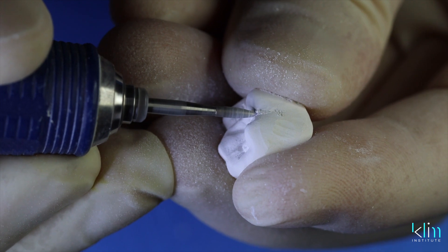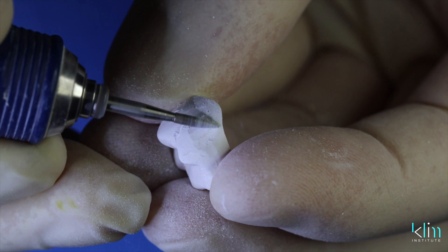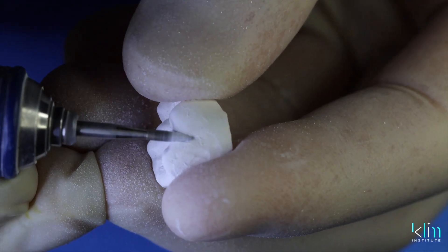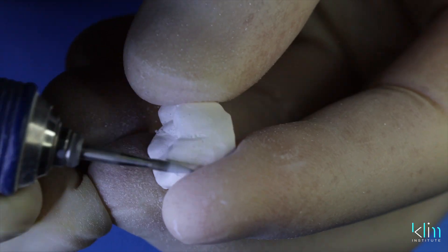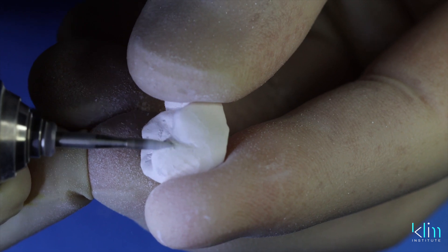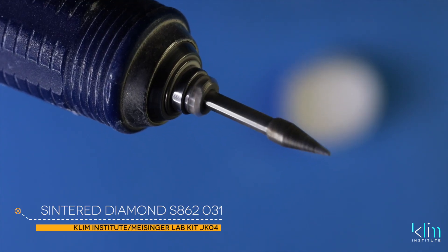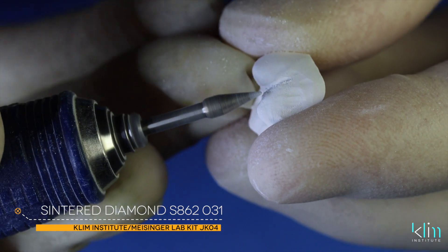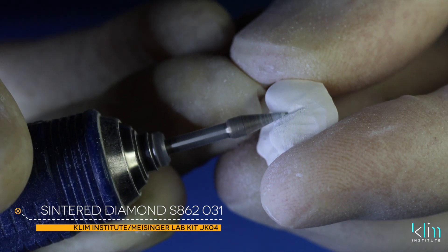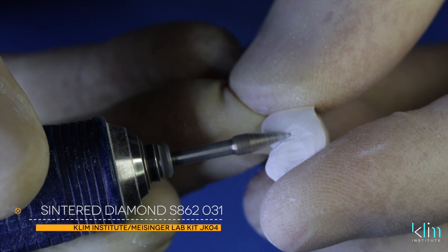On the buccal, we're going to spend a little more time refining that buccal groove so there's more separation between the mesial and distal cusp. Remember, the mesial cusp is a third premolar in the smile secondary zone. The next step is the larger sintered diamond on the JK04 zirconia finishing kit — I like this particularly for finishing off that labial micro-texturing.